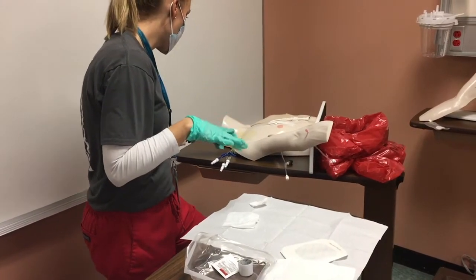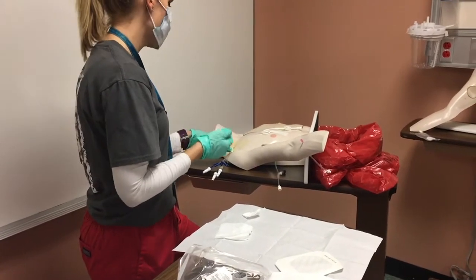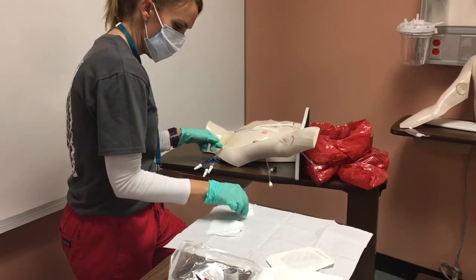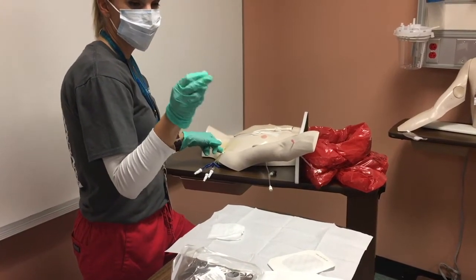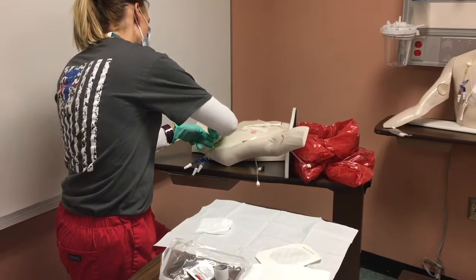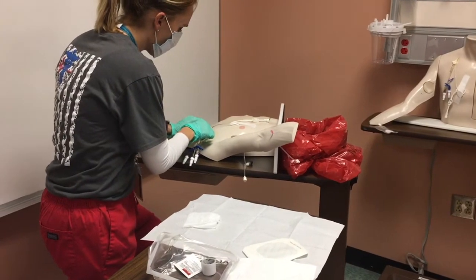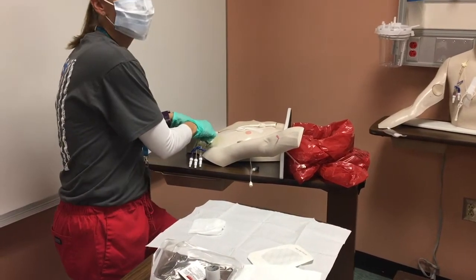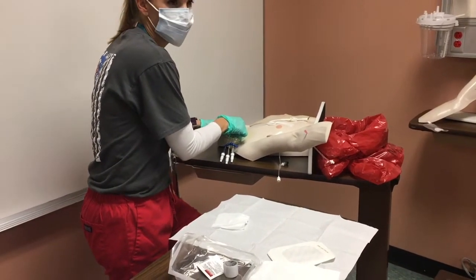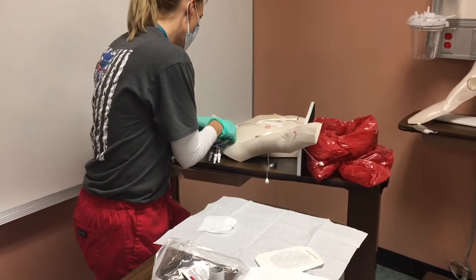I say: sir, I'm getting ready to remove the catheter. When I tell you, on the count of three I need you to hold your breath as I'm pulling it out — you might just feel a little bit of a tug. I have my 2x2 folded up and I place it over the insertion site. I apply enough pressure so I can still pull the line out, but enough so that when I do pull it out it doesn't bleed. I say: hold your breath on the count of three — one, two, three. Okay, you can breathe.